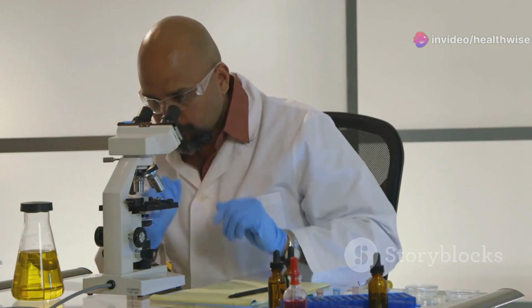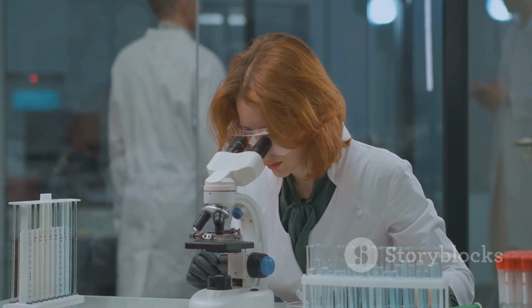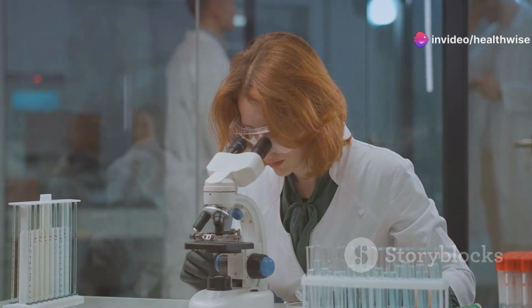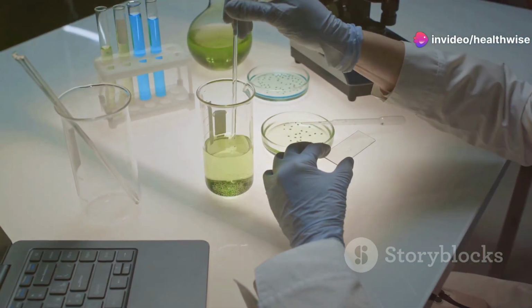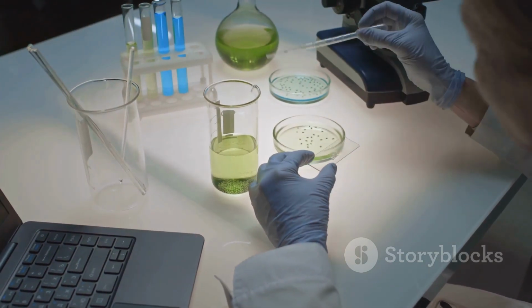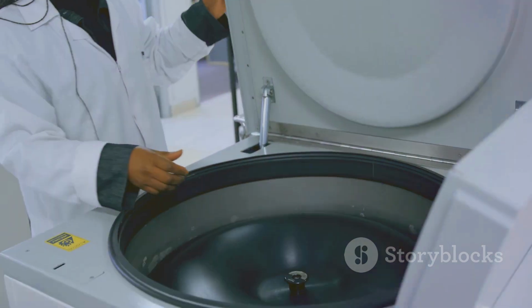First up, we have the formalin ether sedimentation technique. This method not only kills the parasites, but also preserves their morphology, making it a top choice. Here's the step-by-step one. 1. Emulsify about 2 milliliters of feces in 3 milliliters saline in a 15 milliliters conical centrifuge tube. 2. Add saline up to the 15 milliliters mark.